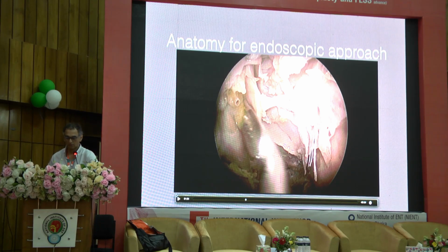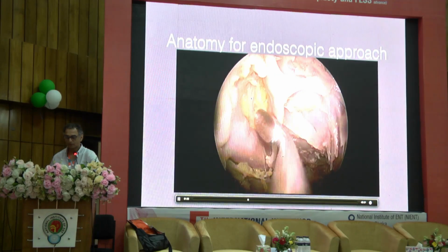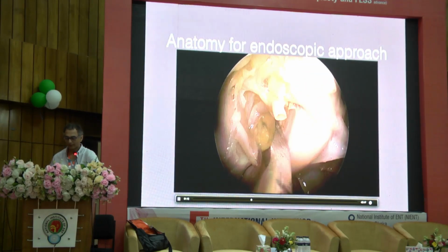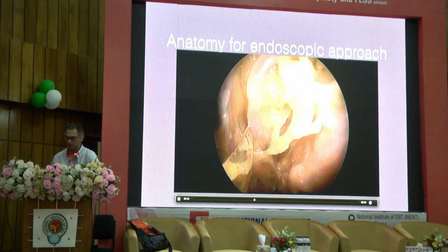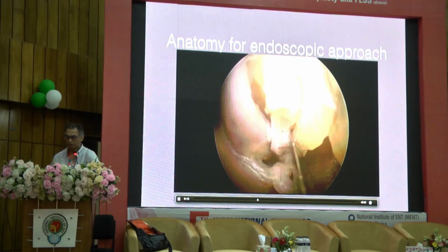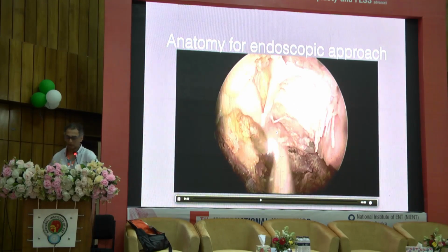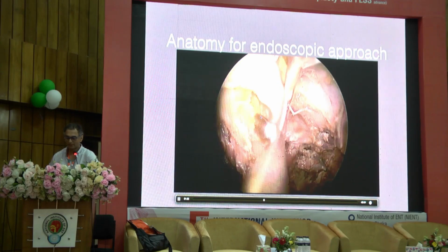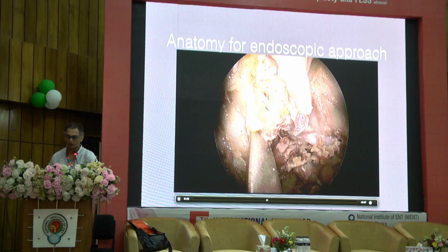Okay, so if we follow that artery back in, we see the ophthalmic artery. If we follow the ophthalmic artery back, you'll see the posterior ethmoid bifurcation, right? So that's the posterior ethmoid now coming into your view. And when we follow that further back, of course, you'll see it coming off the internal carotid. Inferiorly, you have the inferior rectus and the medial rectus, and this is your usual corridor when you're dealing with pathology in the orbit, okay?